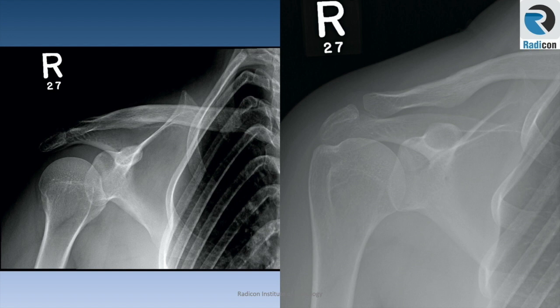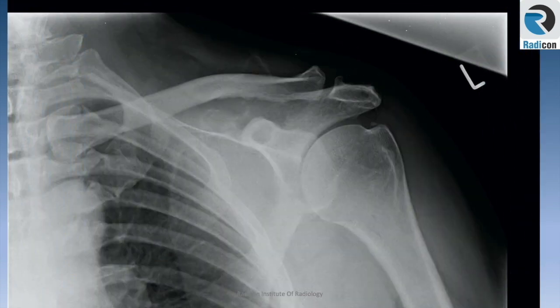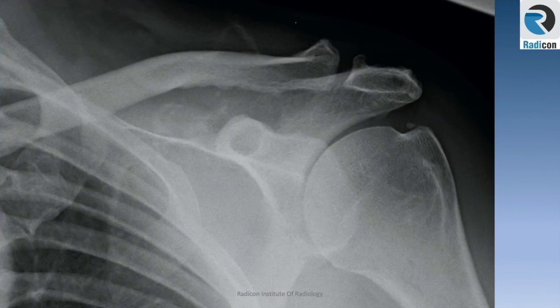Case 34. Left shoulder AP view. The glenohumeral joint appears normal with an intact clavicle. Zooming up reveals some degenerative changes, probably in the rotator cuff and AC joint — not criteria for calling it abnormal in rapid reporting. But there seems to be some abnormality in the scapula. Zooming further reveals a lytic lesion in the superior aspect of the left scapula, with significant bony destruction and soft tissue calcific changes — a malignant tumour is present.